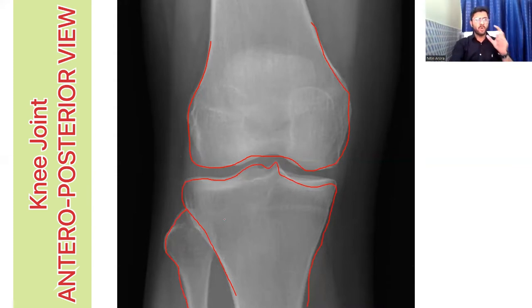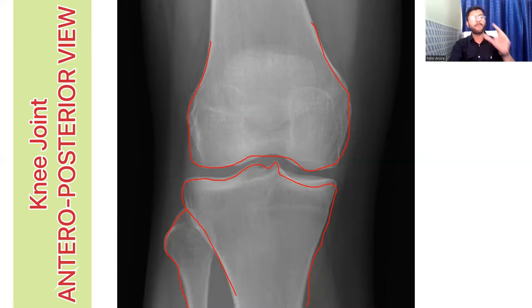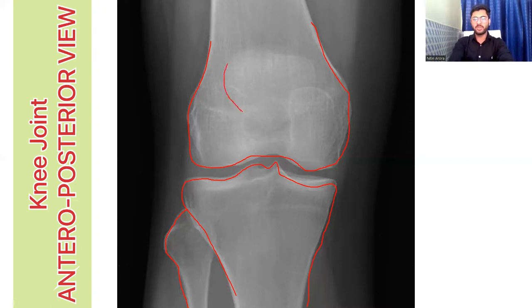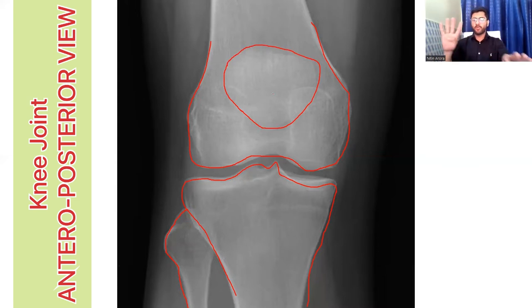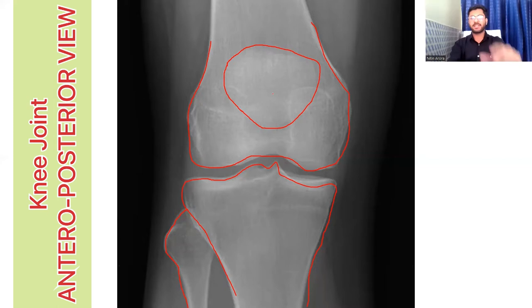Along with that, there is one more thing you need to see in the knee joint — that is what we call the patellofemoral joint, that is the patella and femur. Here you can see the sesamoid bone patella, which is lying in the quadriceps muscle. So now you have four bones that are clearly visible on the knee joint x-ray: femur, tibia, fibula and patella.